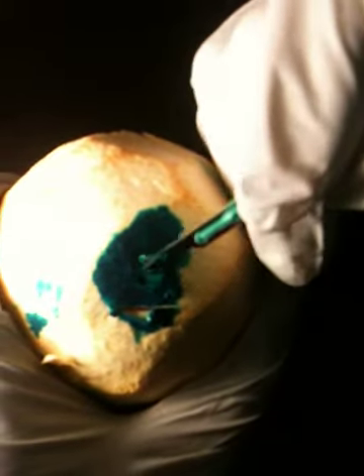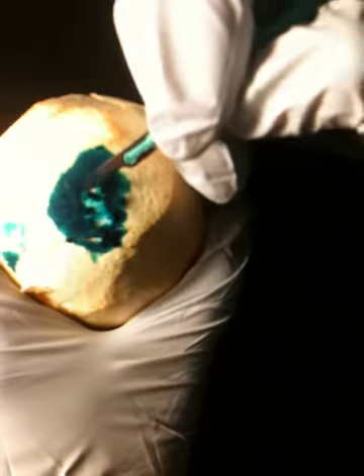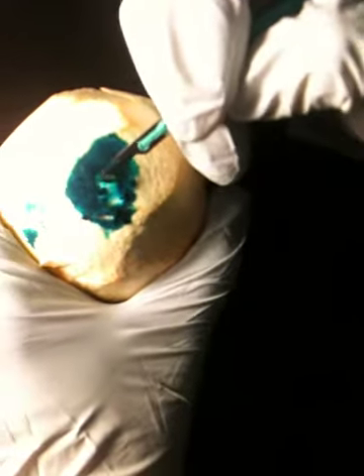So you can see the light bluish tissue here. If we remove slowly, and if we go here to remove it, pretty much you can see, if I remove this, you can see the light bluish tissue, which is very distinct from the dark tissue which was there before. Very clear. There's a little bit of white tissue here, but most of the tissue here is light sky bluish. So we have actually been pretty much successful here and able to remove the tissue.